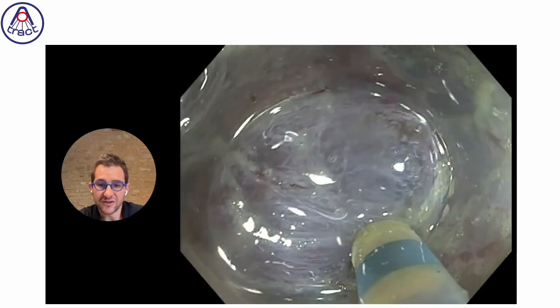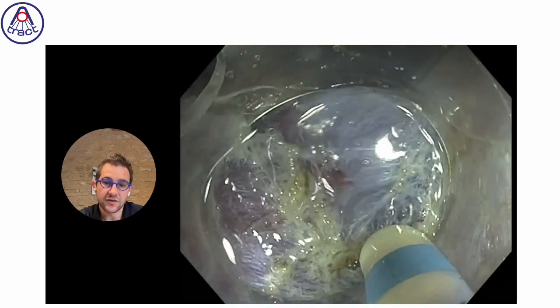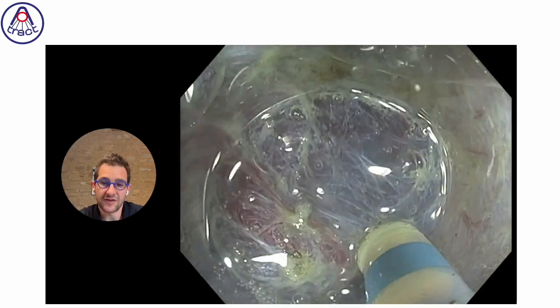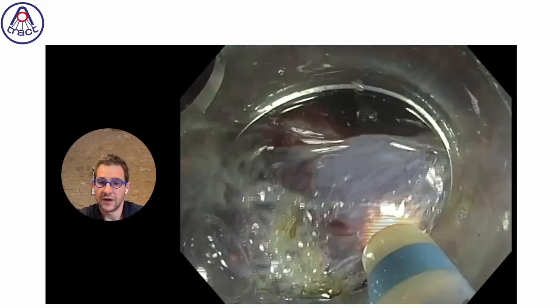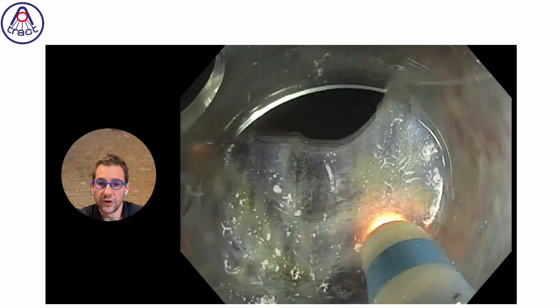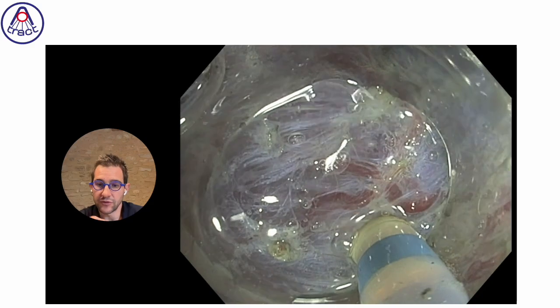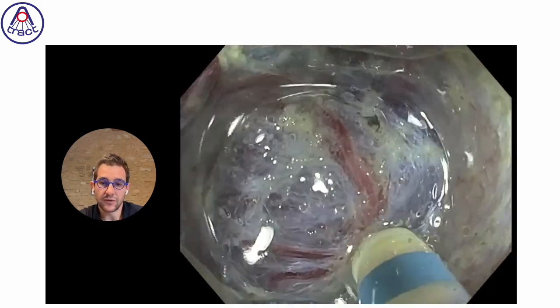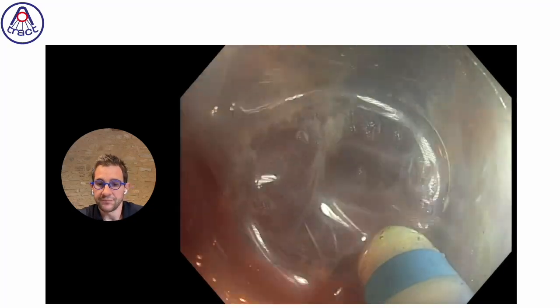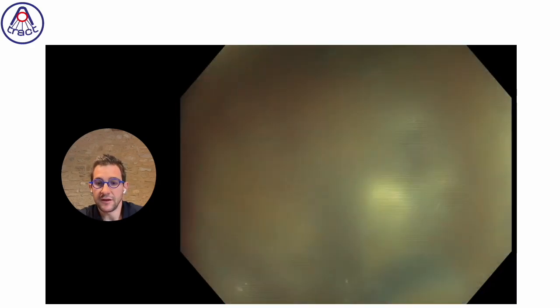If we have no traction, it's more dangerous to begin by the easy part because it's more difficult to achieve once the gravity is really bad at the end of the procedure. So once again, traction is also a way to do the easy part first and to use gravity as a help from the beginning, and not deal first with the bad gravity side, which is more difficult, but that should be first, because if you do it at the end, it will be even more difficult.